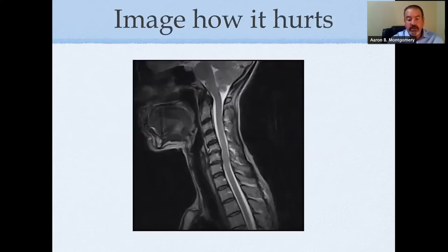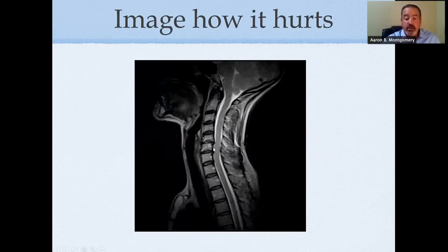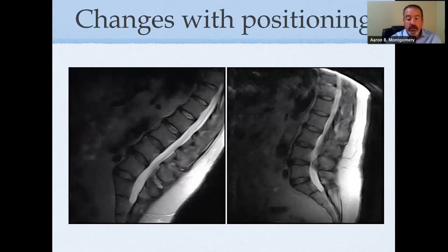But here are some examples. Here's a patient. We see there's a problem at C5, C6 here. And then we go, well, okay, it doesn't look too bad. And then once the patient arches back, which is where their neck hurt, we see disc bulges appearing here as well as here. Again, here we're a little out of alignment, but the patient moves their head forward and we see how this moves forward on this level. Again, here this patient is laying in kind of a 75 degree position, and then we stand them up and we see, whoa, there's a problem there.